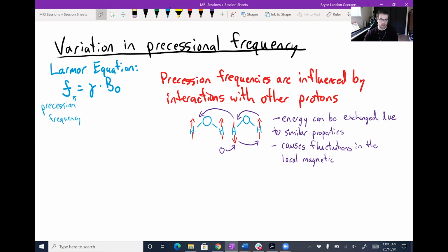This is the first time I touched on this concept, so I probably shouldn't have, just to keep things simple. But you can work with other atoms in MRI that aren't hydrogen protons. It's just generally we use hydrogen because there's a lot of it in the body and it has a large gyromagnetic ratio, which will be relevant for gradients. But there's also sodium imaging, for example, which is another common one. You can work with sodium in the body, and then you get completely different images because the locations where there's a lot of sodium might not be the same as the ones where there's lots of hydrogen. So that's what I was talking about when I mentioned oxygen imaging.